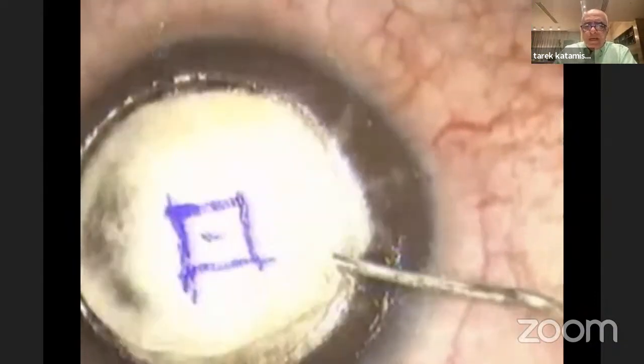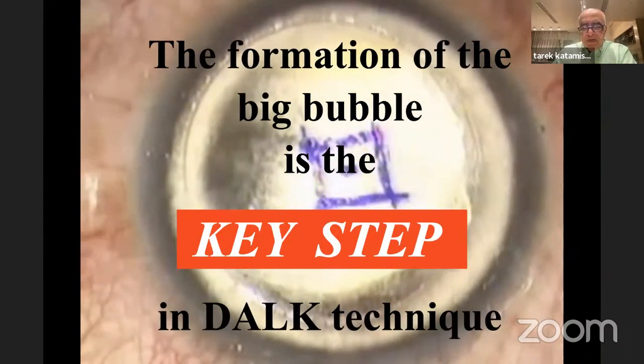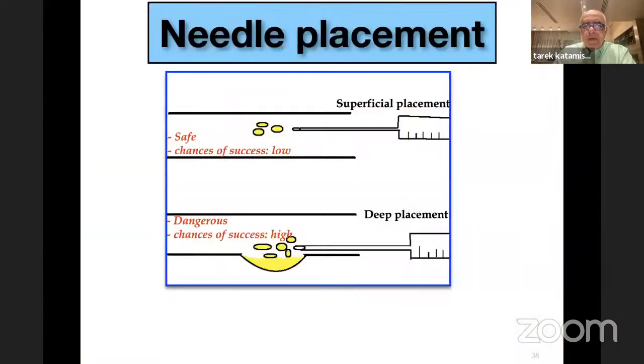As I always say, the big bubble formation is a key step in the operation. So you have to study this bubble very carefully, as I will show you now. Originally, we were using the needle to inject air. If you are using the needle, you will be superficial because you want to be safe. You don't want to injure this membrane, but the chance of success is very low because you are injecting very superficially, away from your target.